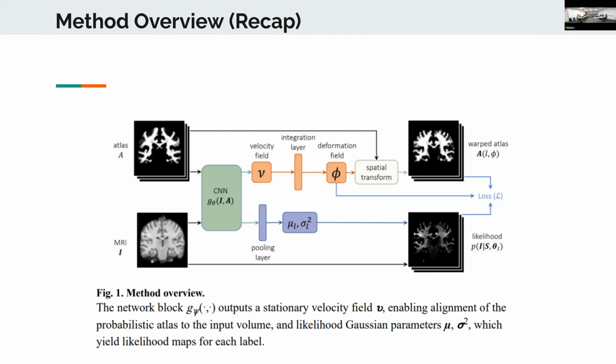I just don't understand the sizes of the tensors. One of them is 5 and one of them is like, let's say, 100 by 100. How do you sample 100 by 5? I don't know. You just sample randomly 100 voxels? Yes. If you have 100 voxels, you just randomly sample from this distribution 100 times. So the more I think of it, consider it multidimensional Gaussian as well, so you can do it as 100 by 100.